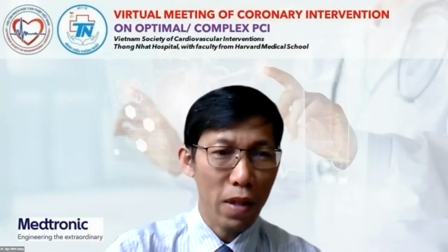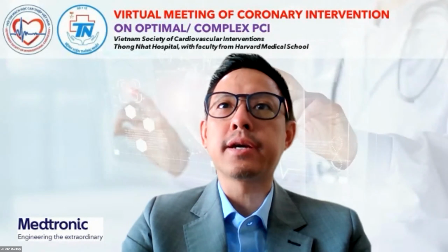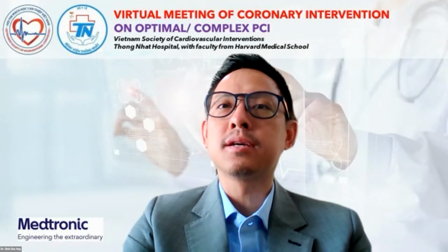Yes, thank you very much. So Dr. Pinto, thank you very much for sharing the case of in-stent restenosis.